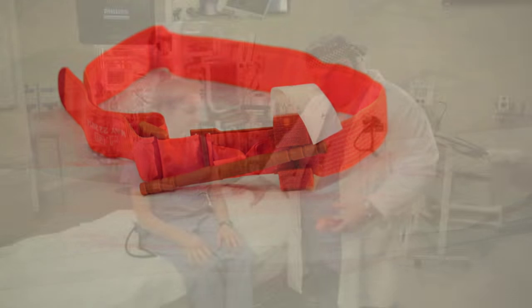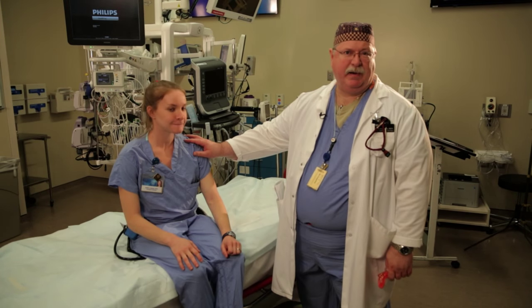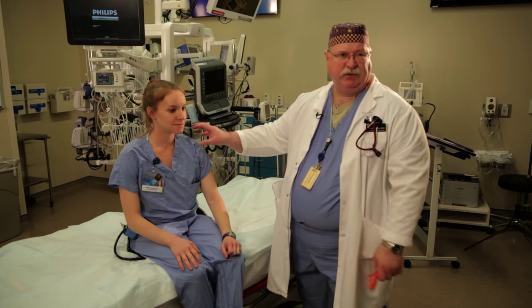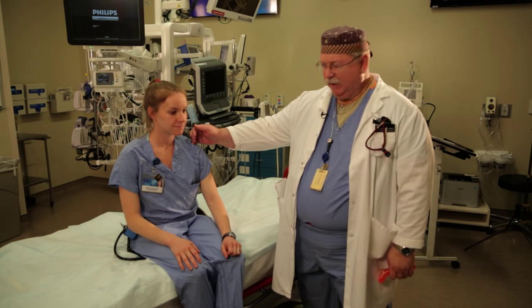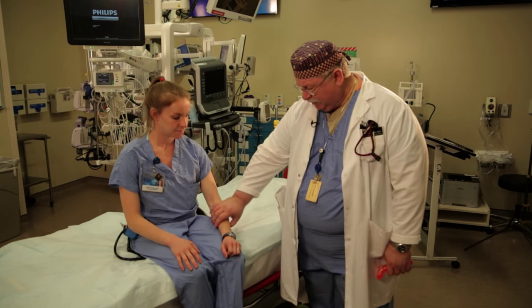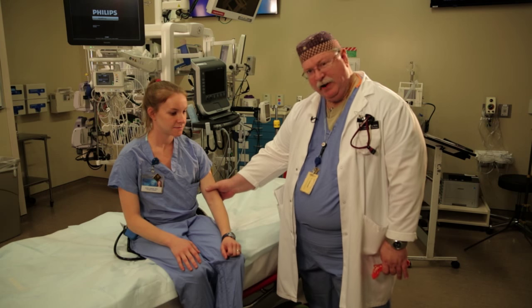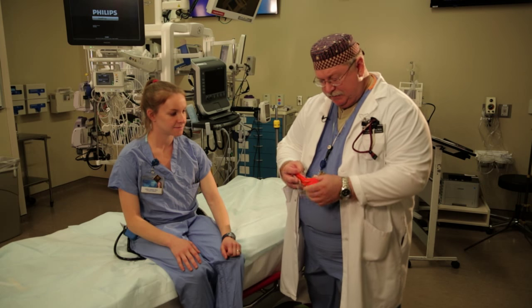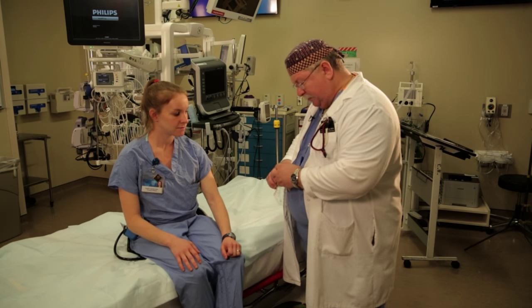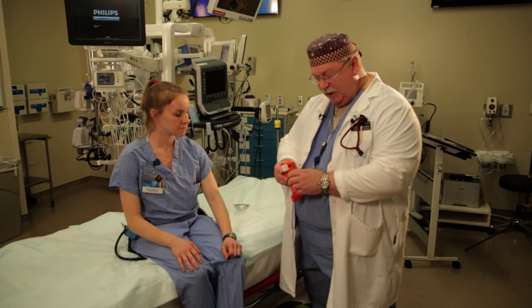What you have to have is a wound that would be amenable to the placement of a tourniquet. If the wound is too high up on the body, then there's no way to get the tourniquet between where the wound is and the heart. So if the wound is here in the forearm, you can put a tourniquet on above that level or even higher up if you want to. These tourniquets are manufactured specifically for hemorrhage control purposes, have been tested, and they are endorsed by the Committee on Tactical Combat Casualty Care.